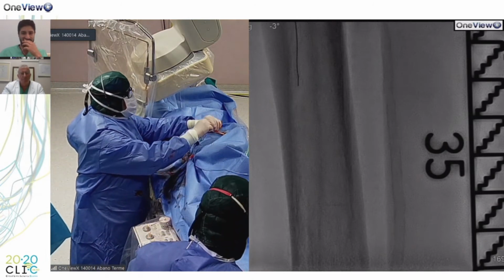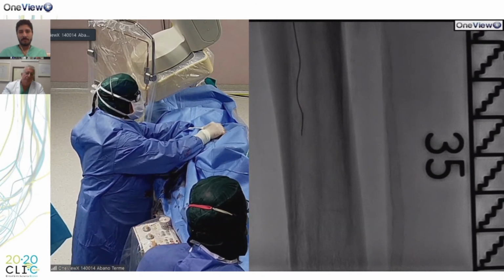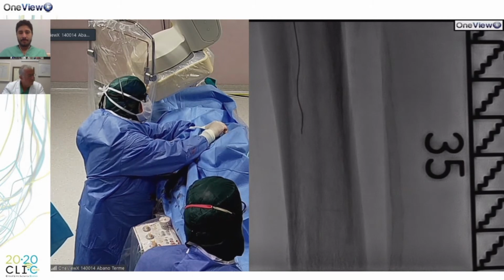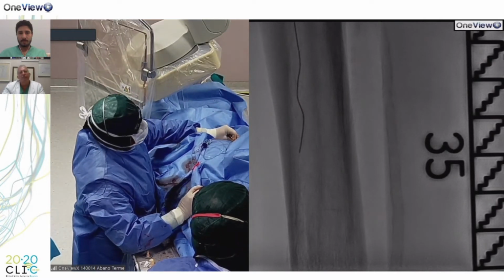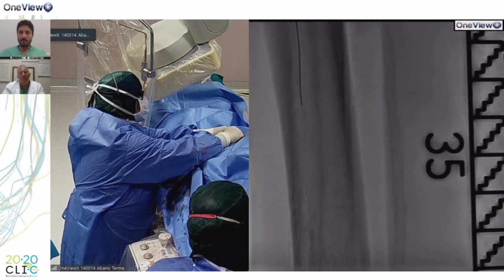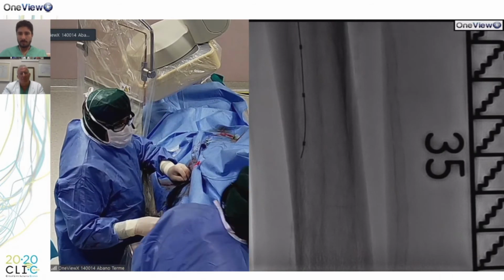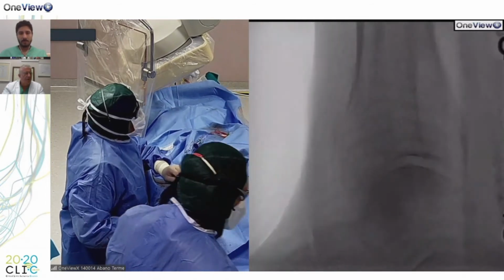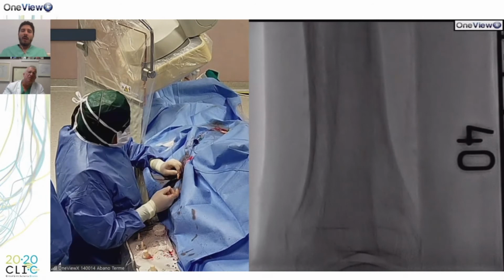So I inserted now a microcatheter. It's a Rubicon catheter 1.8 from Boston. And we try to support the V18 with this microcatheter that would have much more chances to follow. You can see how difficult it is to arrive. Okay, torque again, please. And now we have to cross the last mile, trying to arrive in directly.